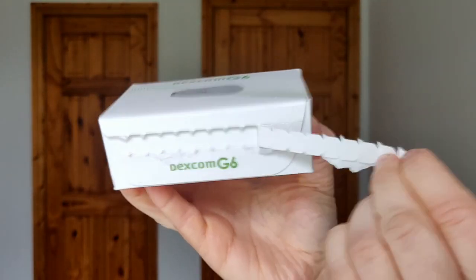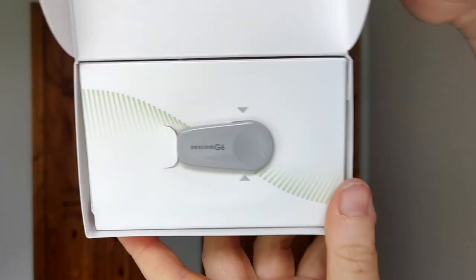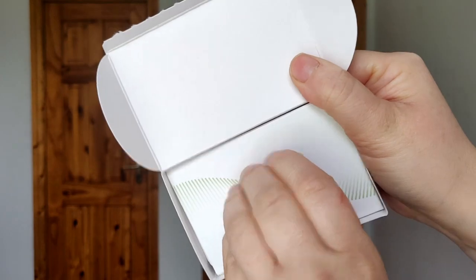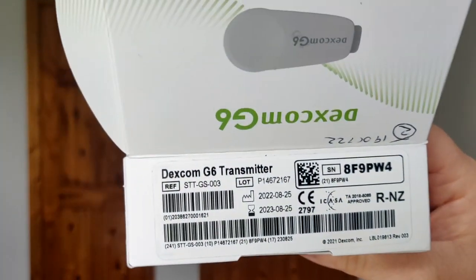Here is my new transmitter, sent to me by Dexcom. I'm going to open it up for the first time. There's a tab on here that you pull off, and you can see how small it is — this is the new transmitter ready to go. I'll take it out of the box and there we go.